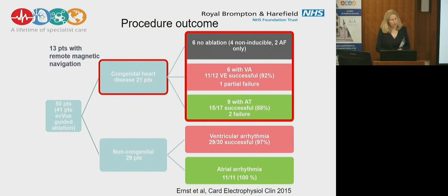We could actually also identify patients who, despite reporting typical palpitations, we could not induce at all in the non-invasive phase, and at some point I stopped taking those people to the lab, because if you try for 8 hours to provoke them on the ward whilst they're awake and not sedated and not exposed to any kind of anesthesia, this will not happen in an EP setting even better.